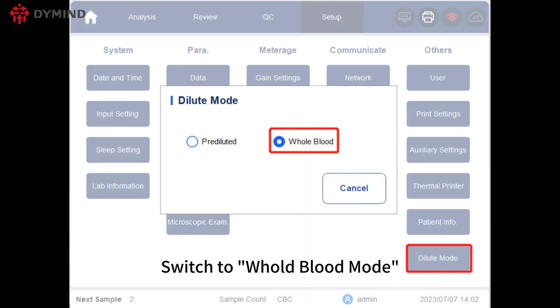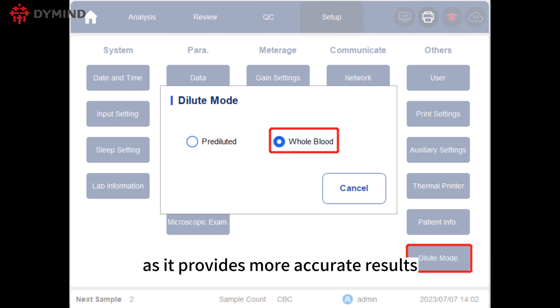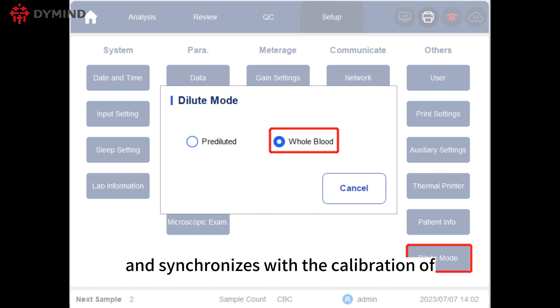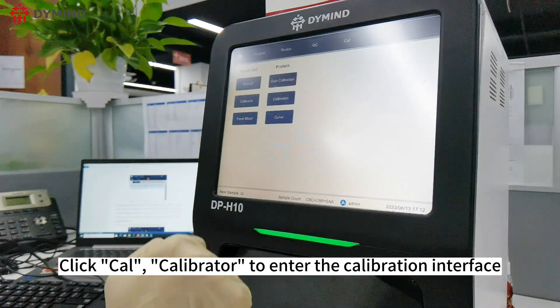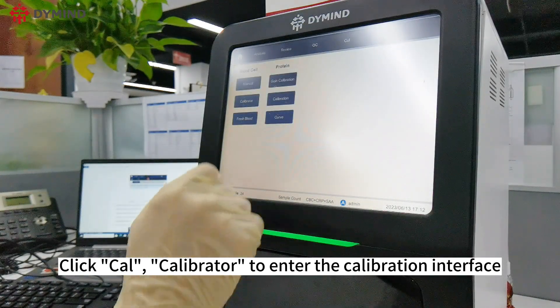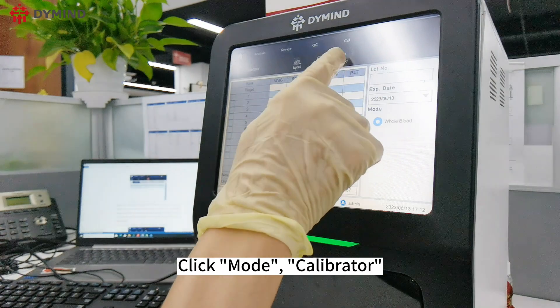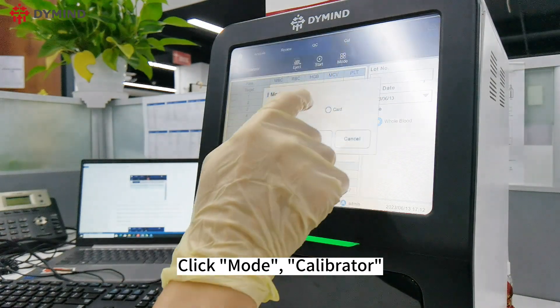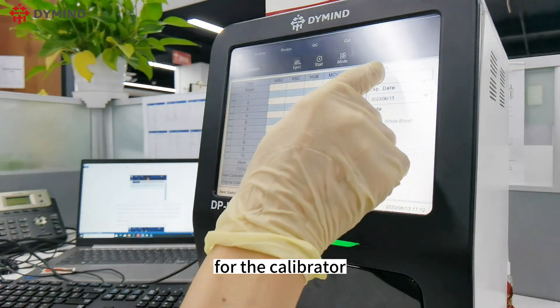Switch to Whole Blood mode — we recommend using this mode for calibration as it provides more accurate results and synchronizes with the calibration of the pre-dilution mode. Click CAL, then Calibrator to enter the calibration interface. Click Mode Calibrator and enter the relevant batch number information for the calibrator.